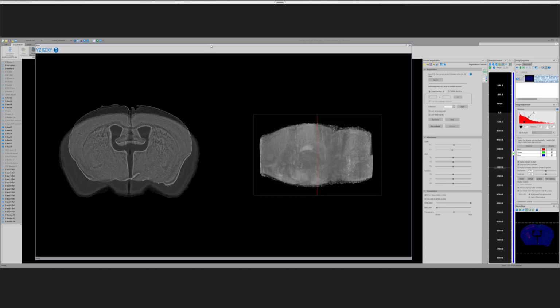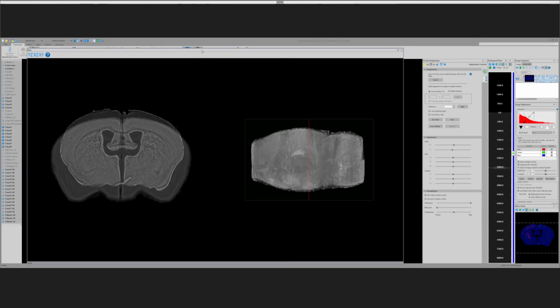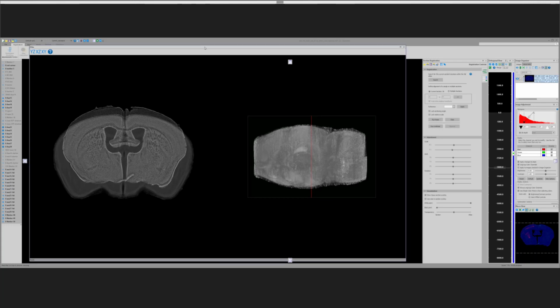So this is a window. If I could just jump in there, Chip, we also do support cross-modality registration. So if the modality you're using doesn't exactly match the reference image in the atlas, we can still do the registration. But in this case, because we have a modality that matches what you use in your lab, it's a good reference to use.